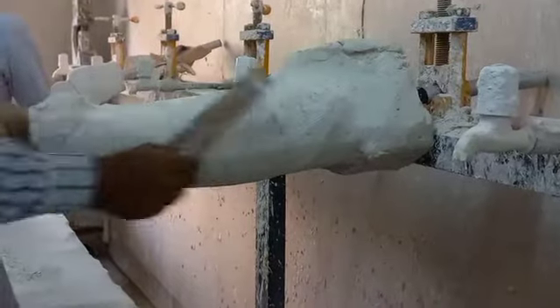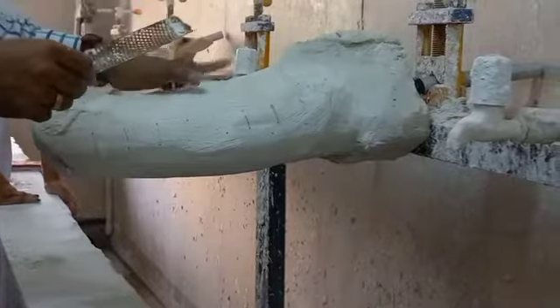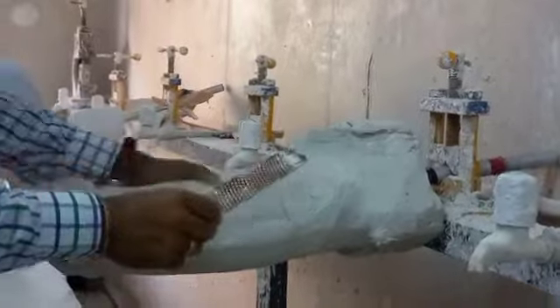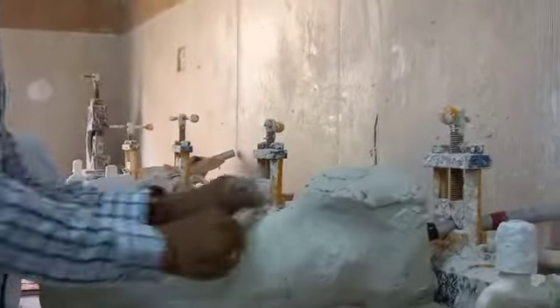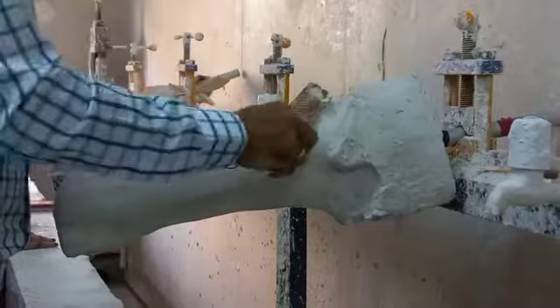Certain areas are very soft and certain areas are much harder because we have added some material in the dents that is getting harder. So it's difficult to flatten that. Let's say do only a little bit of reduction and then wait for the measurement of our model.